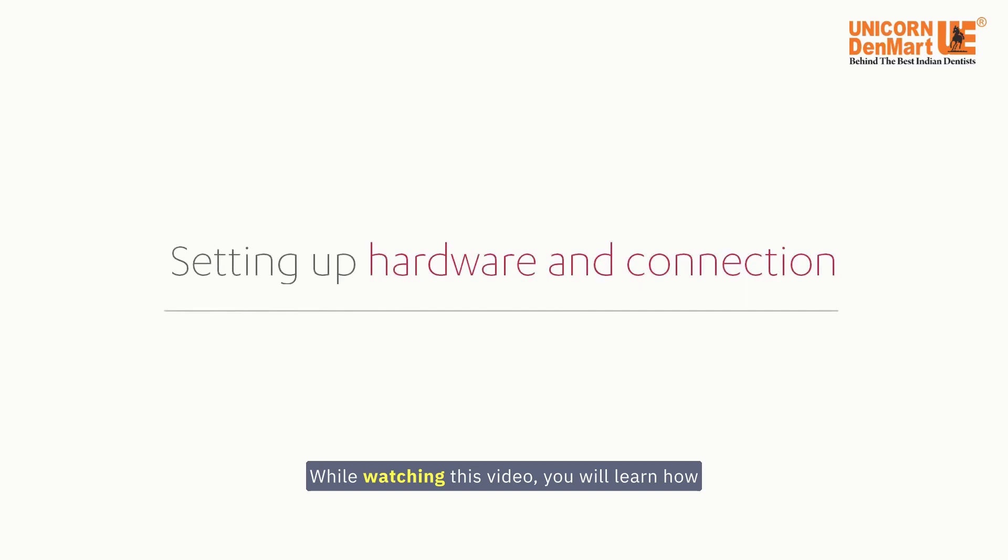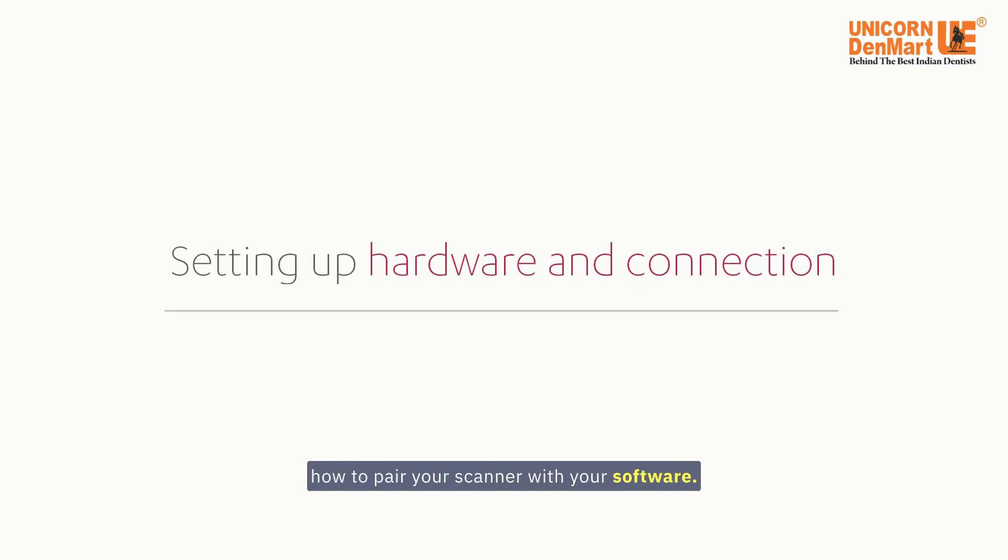While watching this video, you will learn how to set up the TRIOS wireless hardware and how to pair your scanner with your software.